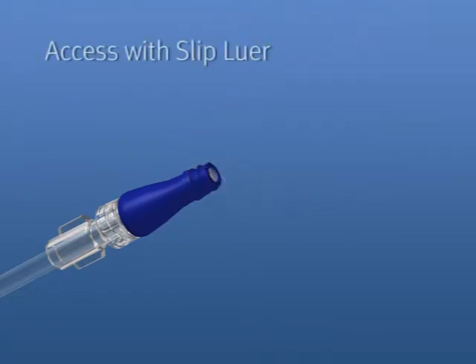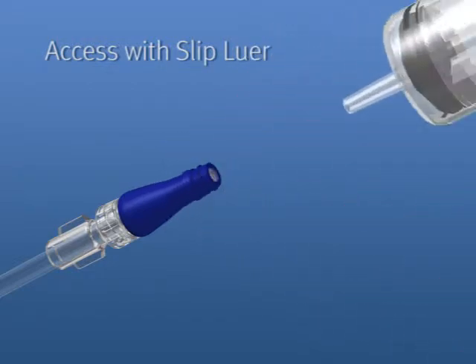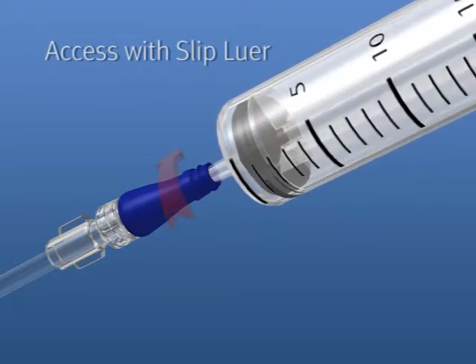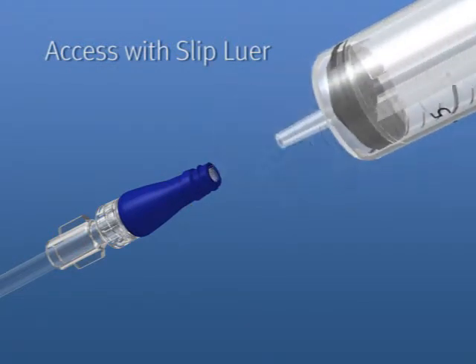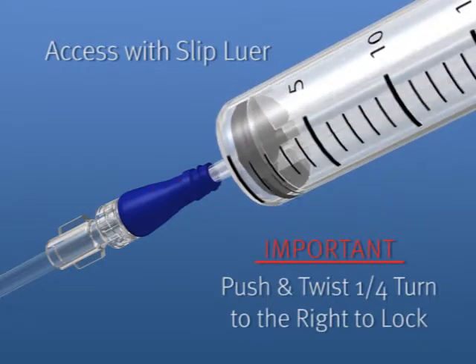To access the MicroClave with a slip luer, swab the top of the connector with alcohol, insert the luer into the MicroClave, push and twist 1/4 turn to the right to lock the luer in place. It is important to push and twist 1/4 turn to the right to ensure a secure connection.